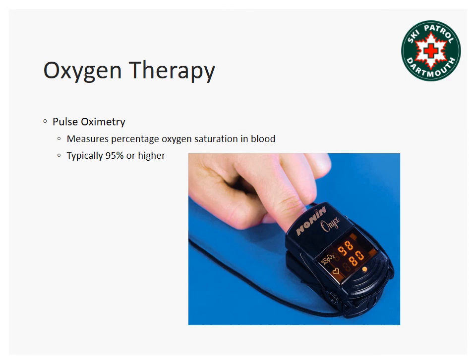Another tool that we have in our oxygen kits is the pulse oximeter. And this shines a specific frequency of red light through the patient's fingernails so that we can tell what percentage of the hemoglobin in their blood is saturated with oxygen molecules. And we want that to be greater than 94%. 95 or higher is a perfect A for the patient on their oxygen. So if they have that, they probably don't need supplemental oxygen.